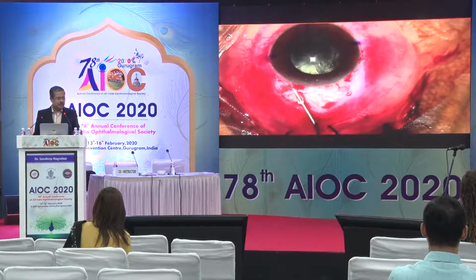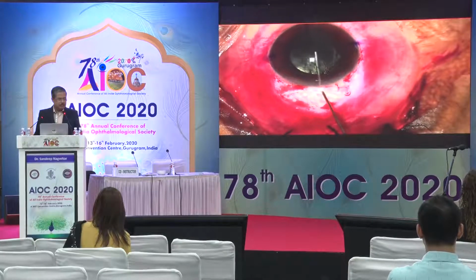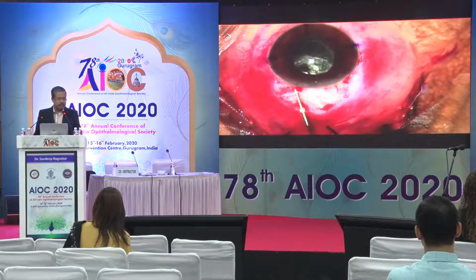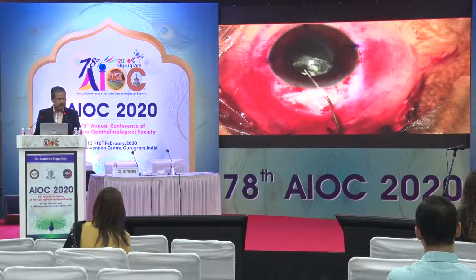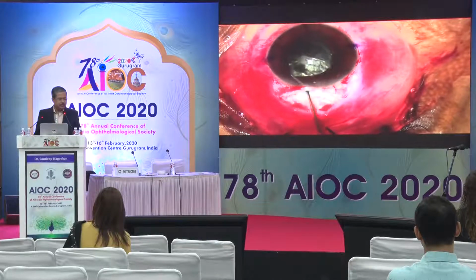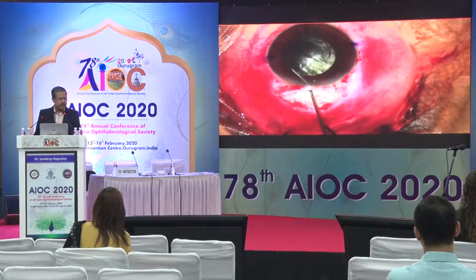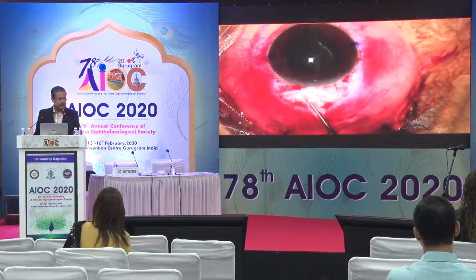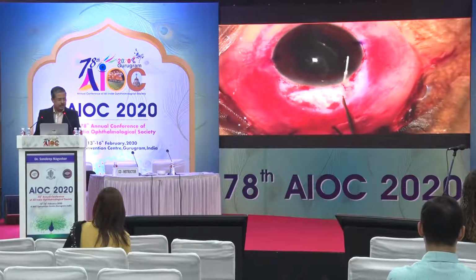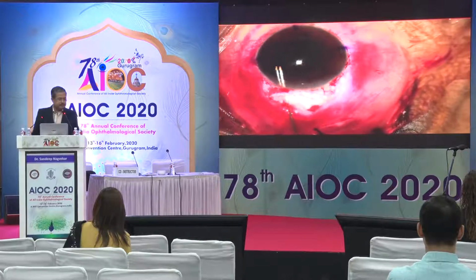As you can see out here, after we have done a large rhexis, the classical wave that we like to see, we ensure, first of all, the lens moves, and then, of course, put in that fluid wave so that the pole pops up from the other side. As you can see, the wave of hydrodissection moves against the posterior capsule, and we're just waiting, yes, and then it pops out. And once it pops out, it's not that difficult. You rotate it around and spin the lens out of the capsular bag.